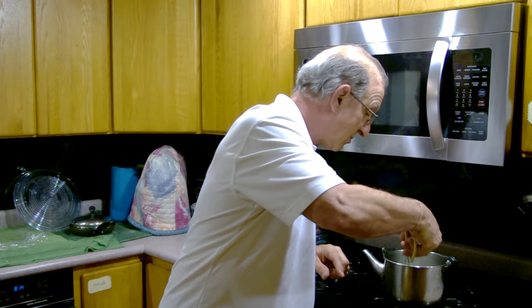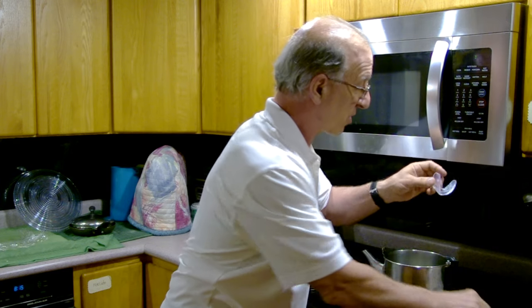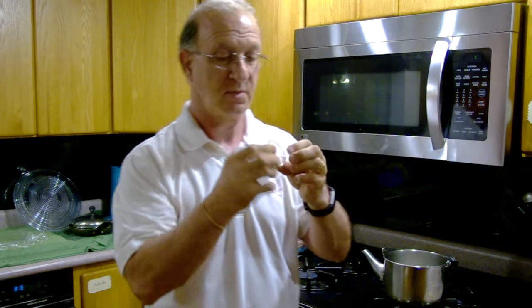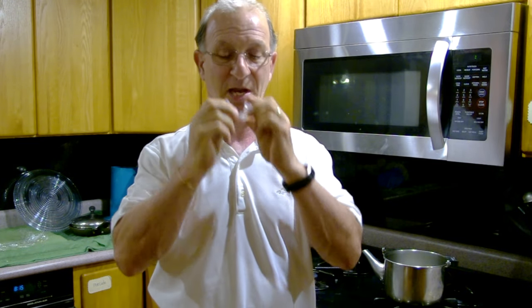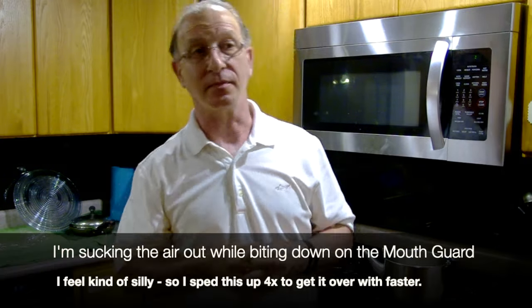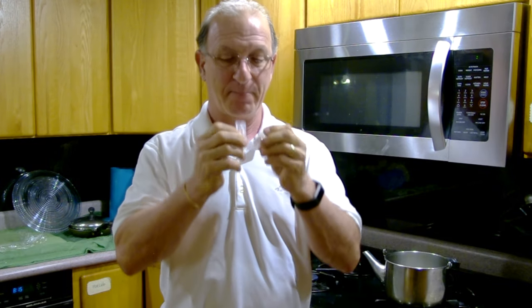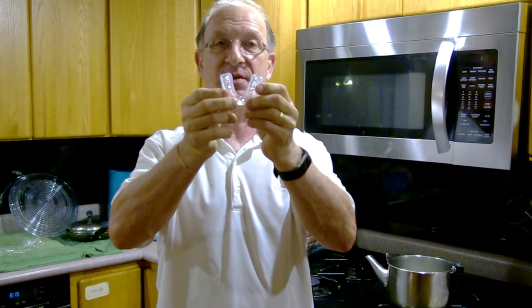Now it's shrinking and there it is. You don't want to put it in your mouth right now because it's pretty hot. You want to get it centered, open it up a little bit, bite and suck. And that's it — it's custom fit to my mouth.